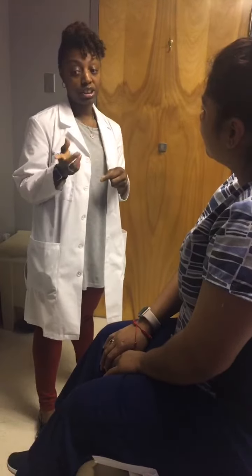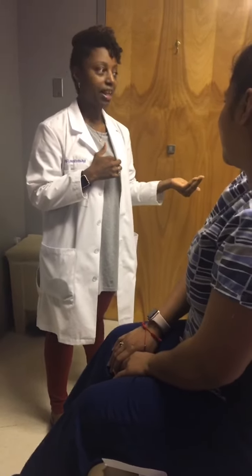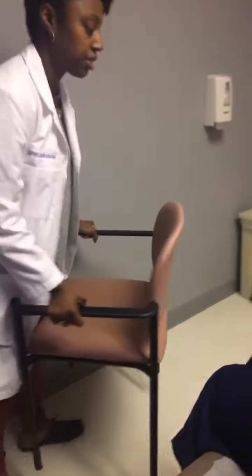Talk about drinking water. We're going to move you into another chair. Your blood pressure is actually okay. Are you on any medicines for blood pressure? No, not right now. Not right now — because you're still in the in-between phase, correct? Yeah. All right, so let's get you in a better place to check your blood pressure.